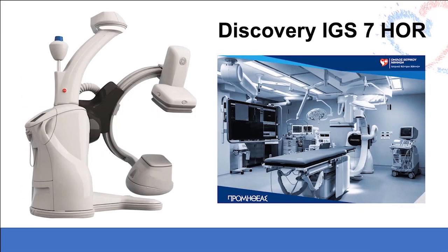So this is the hybrid room, the Discovery IGS 7, and this is the place where we are working, a very nice hybrid room where we have developed all these standard programs for the aorta, for the peripheral, and also for the veins.